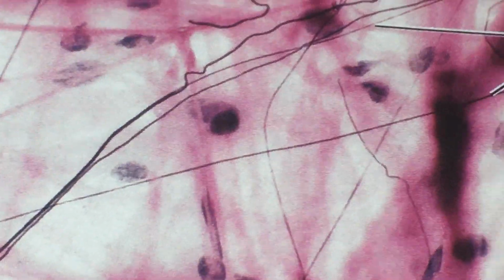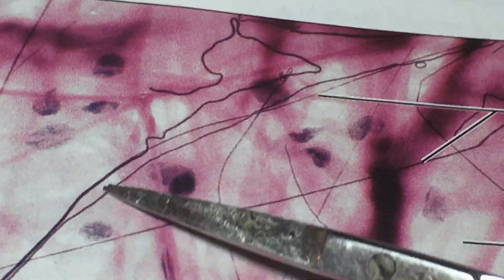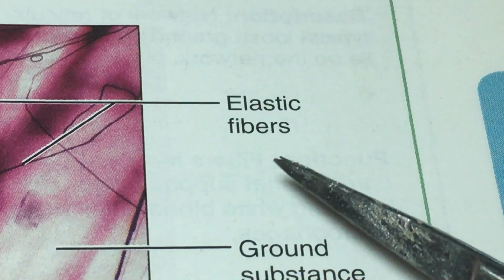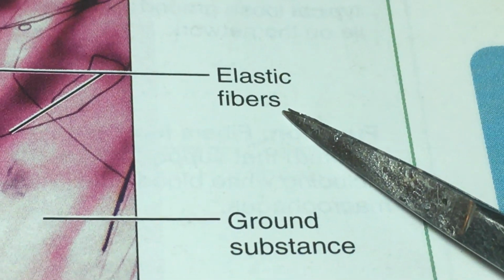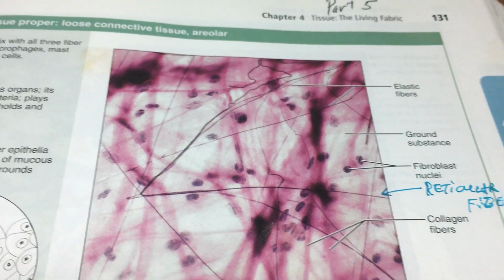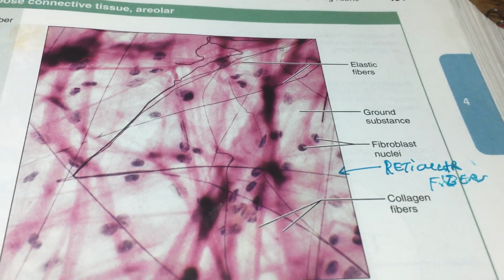And then we have some other cells that may or may not be easy to identify, and the author is not trying. We do see here this little curlicue right there. That would be an elastin. Okay, so the idea here is that we have elastic fibers, which have a little recoil to them. Okay, so that's the whole thing.